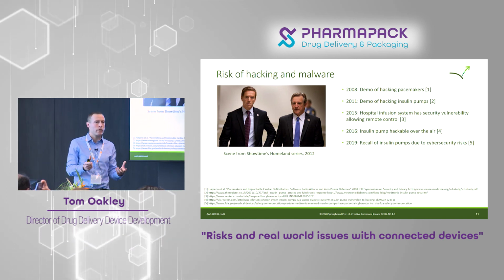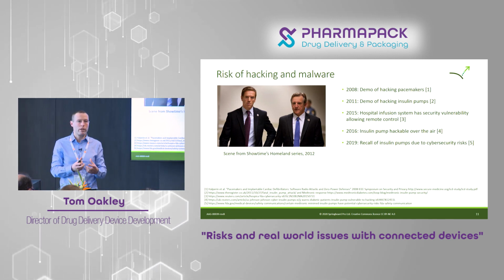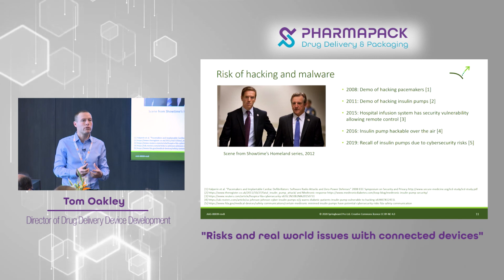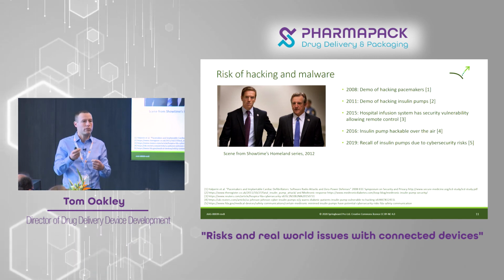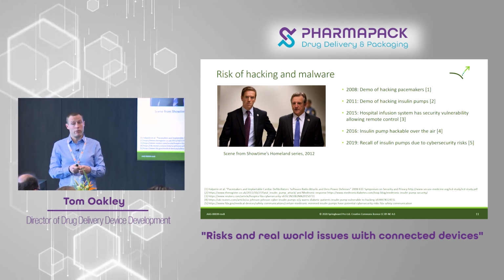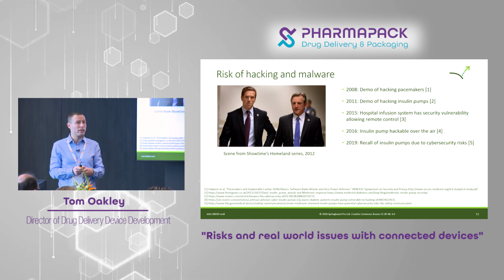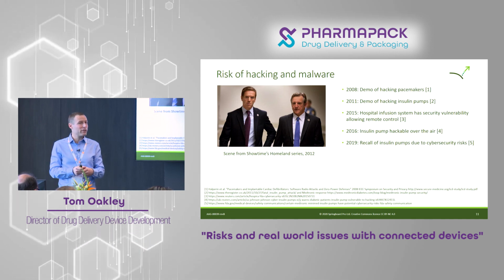So with encryption keys, one of the main properties of a good encryption key is that it's extremely difficult to guess. You can't brute force it. You can't just try lots of encryption keys and get the right one. A company used an encryption key, which is a good idea, but the encryption key was the serial number of the device. So you didn't even have to get to that device.